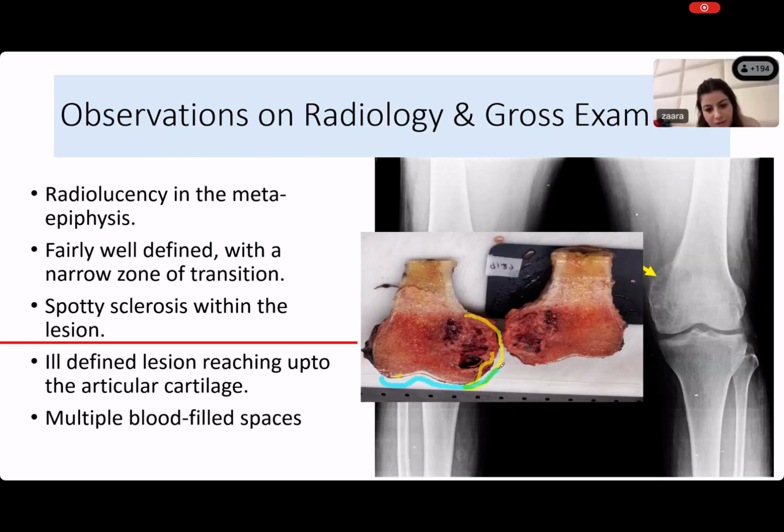Epiphyseal. So now Zara thinks that this is epiphyseal cartilage. All right, Prayas. You are the last person now. I can see beautiful white cartilage here. Cartilage looks white, right? So Prayas, what cartilage are we seeing? This cartilage, which has been outlined by Zara and me. She thinks it's epiphyseal cartilage. What do you think?